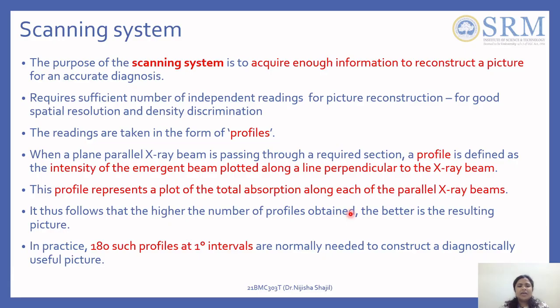In practice, what they usually do is take 180-degree profiles. You have 180 such profiles, one per degree. You take them at small intervals and then construct them to get a diagnostically useful picture.